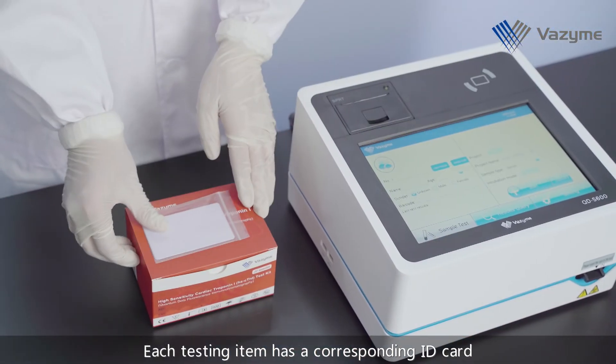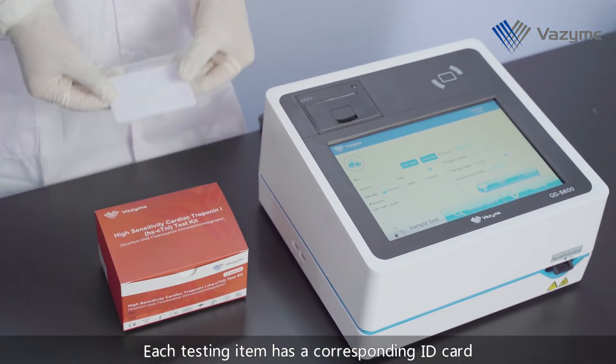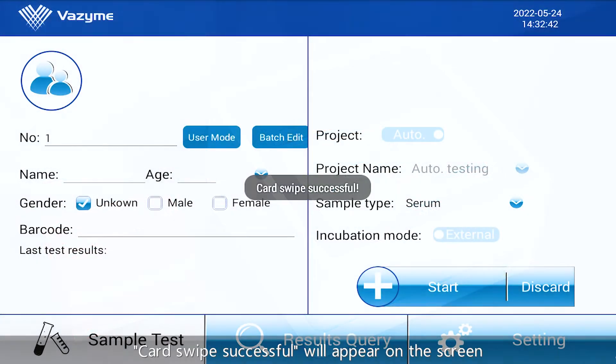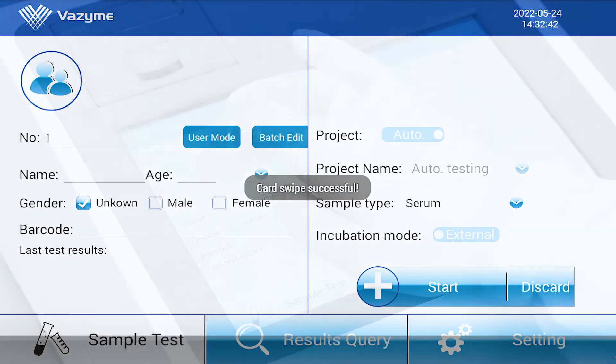Each testing item has a corresponding ID card. Please take the ID card of the target testing item and swipe it here. Card swiped successfully will appear on the screen. Tap Sample Test Page.